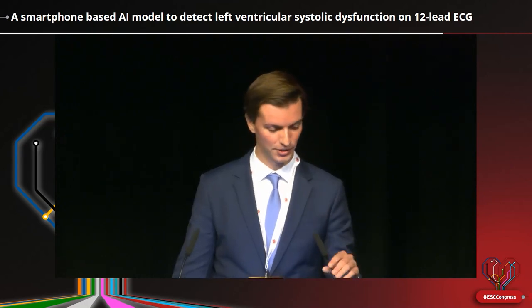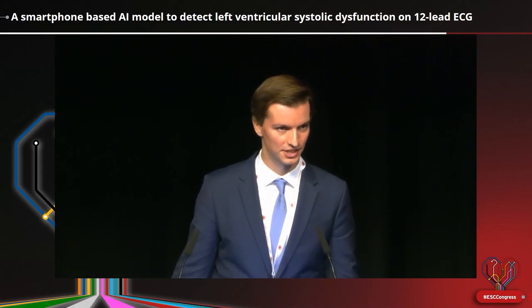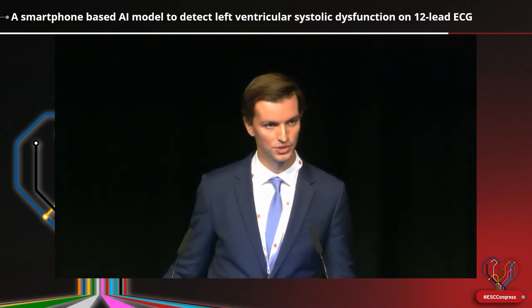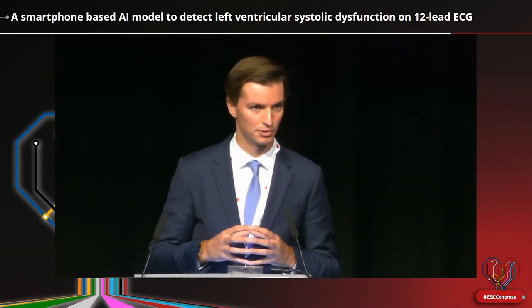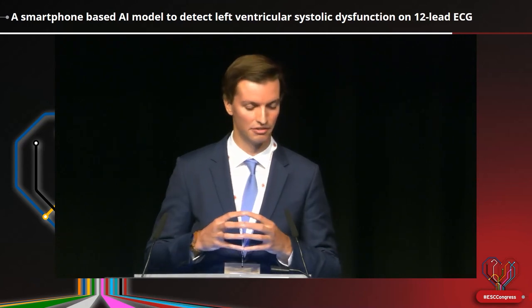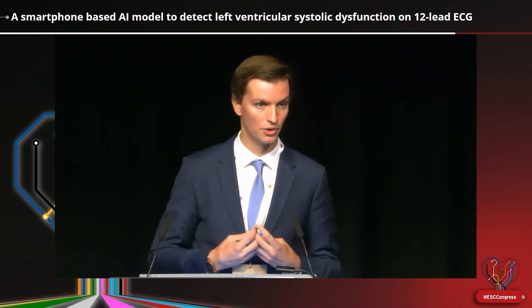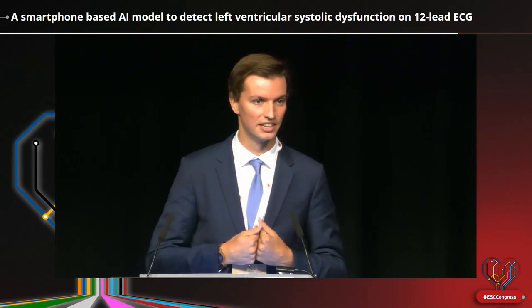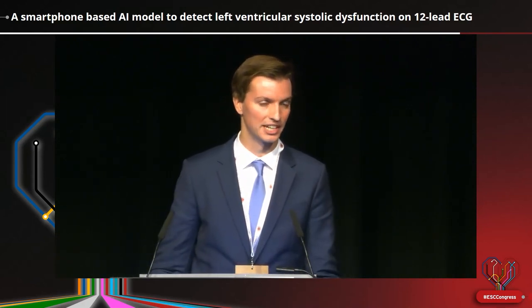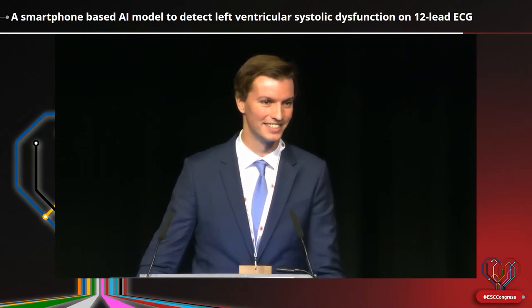Absolutely. I fully agree. This is a very important comment. First of all, the model was indeed trained on the raw ECG signal, but in our validation set, we also simulated the digitization because we know the digitization process inside and out, and we can replicate this process and apply it to the digital signal to see if we can achieve the same performance in these digitized ECGs. Second, we have ongoing external validation studies using the smartphone application to digitize the ECGs. And there in preliminary results, we show that the performance is actually consistent. But unfortunately, at the time when I had to submit this presentation, I was not able to add the analysis results yet. Sorry.